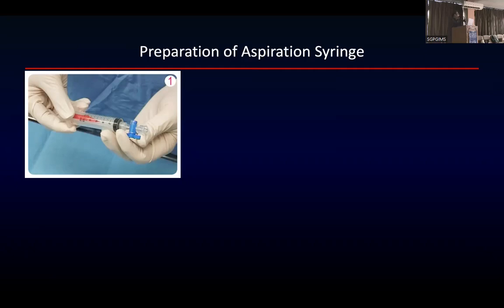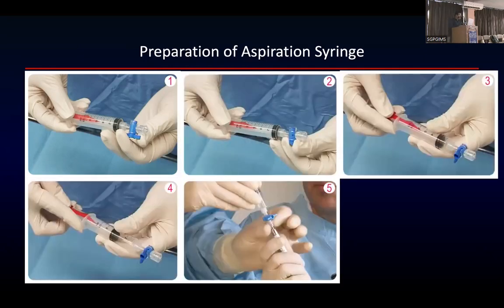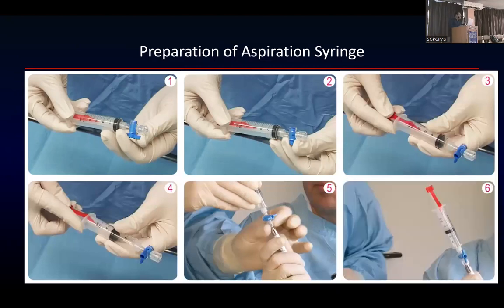Okay, so the practical aspect is first pass without suction. See the aspirate. If it's okay, you do again without suction. If there is no sufficient material, you apply suction. That's what the logical thing is. Okay. Suction कैसे लगाना है? अभी आप देखेंगे वहां भी अगर suction use करते हैं, ये syringe में आपने negative pressure create कर लिया और आपने इसको पीछे उसके needle के tip पे आपने इसको लगा दिया. This is how it is loaded.